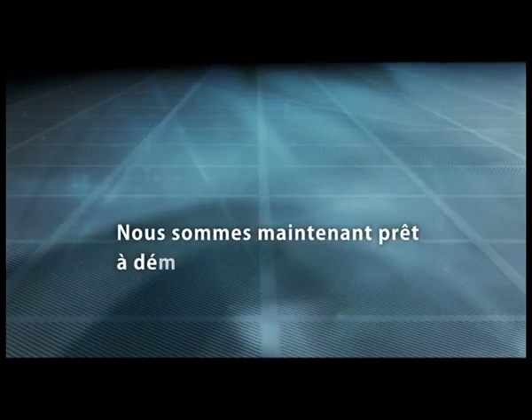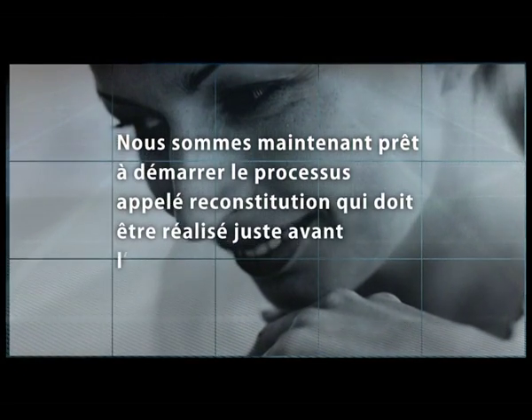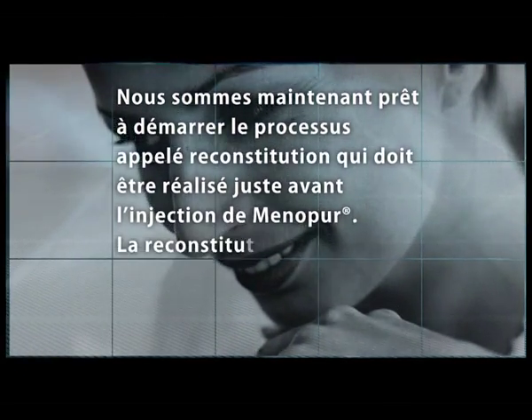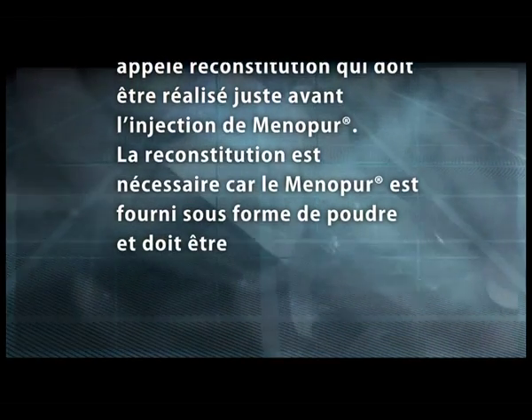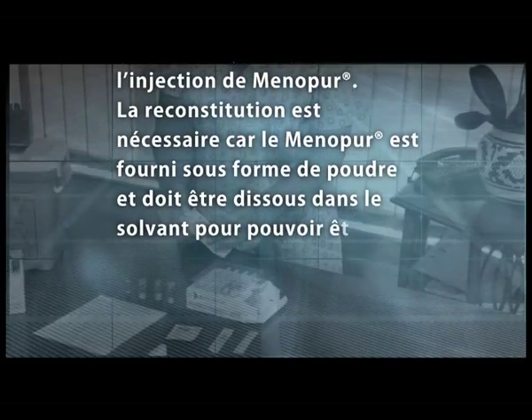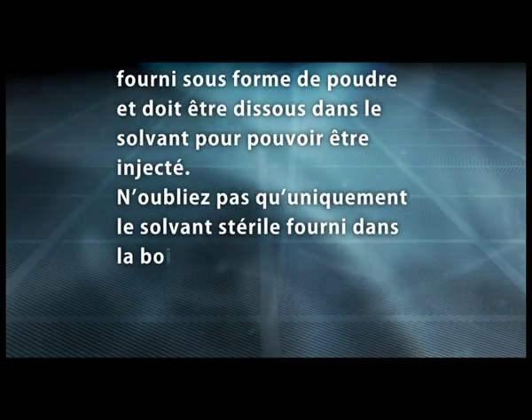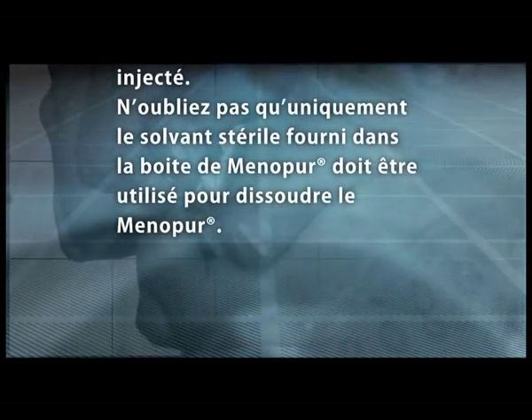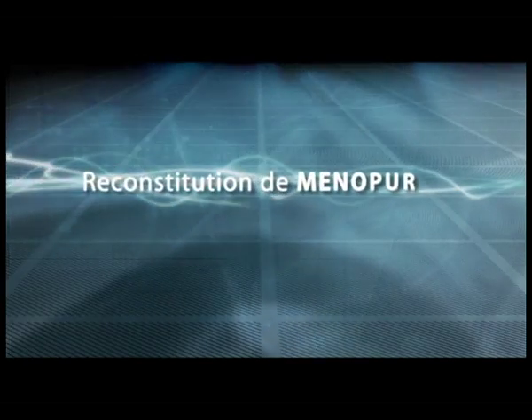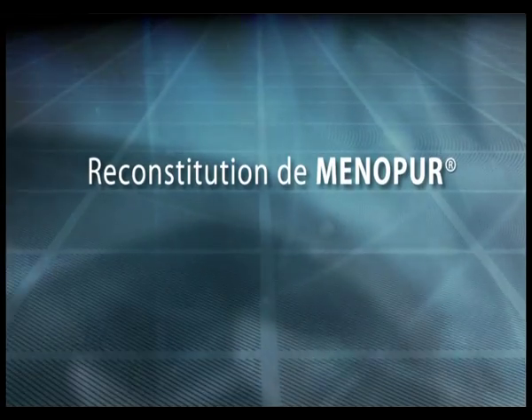We are now ready to begin the process called reconstitution, which must be done immediately before injecting the Menopur. Reconstitution is necessary because Menopur comes in powder form and must be dissolved in the solvent in order to be injected. Remember, only the sterile solvent which comes packaged with Menopur may be used to dissolve the Menopur. A healthcare provider will now demonstrate what you need to do when mixing it yourself.